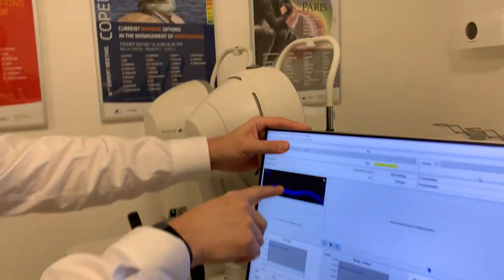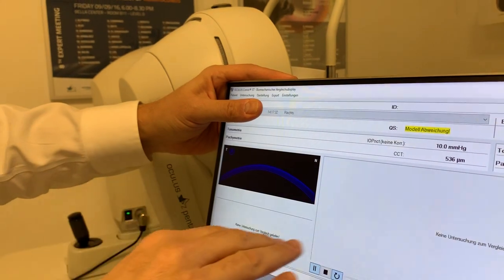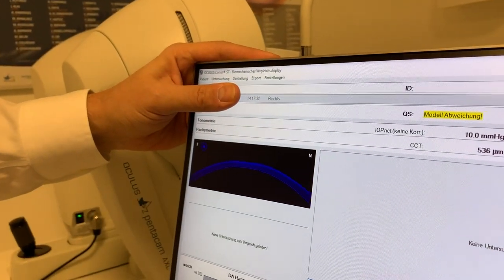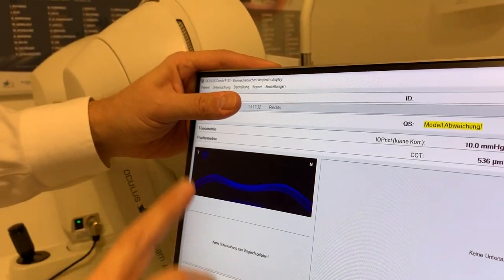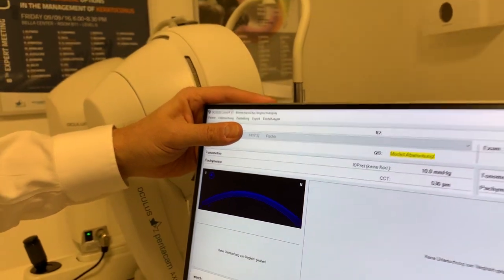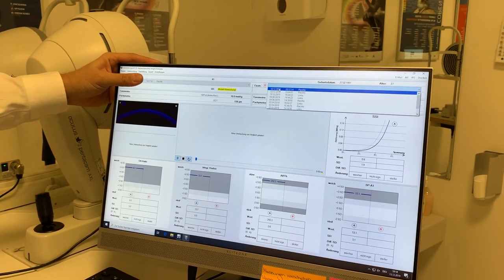This is the patient's cornea before crosslinking. A strong air puff makes an indentation of the cornea, and we can measure the deformation — how fast it deforms, how long it takes the cornea to get back, and how it behaves during the air puff. And now for the very first time, we can plot this before and after. Look at this.